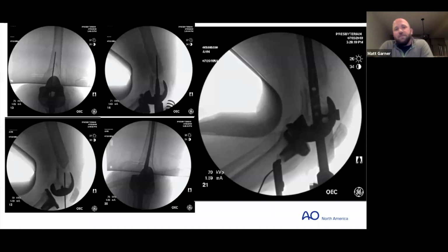I pull the nail and I put a blocking screw in. To me, that lateral looks like the nail's in an appropriate position in the distal block, and it's too posterior in the proximal segment. And to John's point earlier, that's that bell clapper effect that has been written up. So the nail comes out, a posterior blocking screw goes in. I'll also use blocking wires because I'm not the best at putting my screws in the right place. So I'll put something in that can easily be removed.